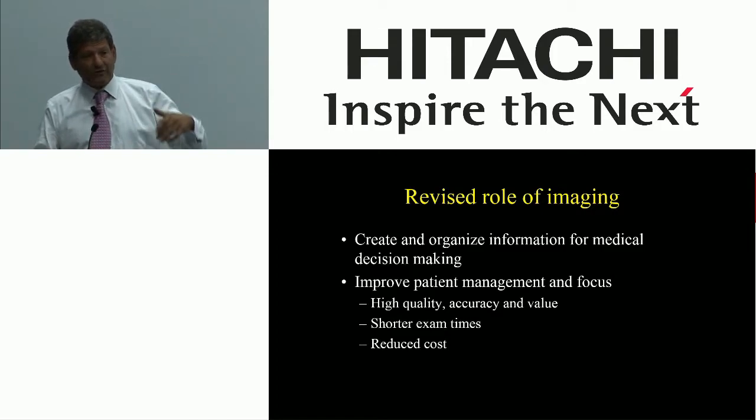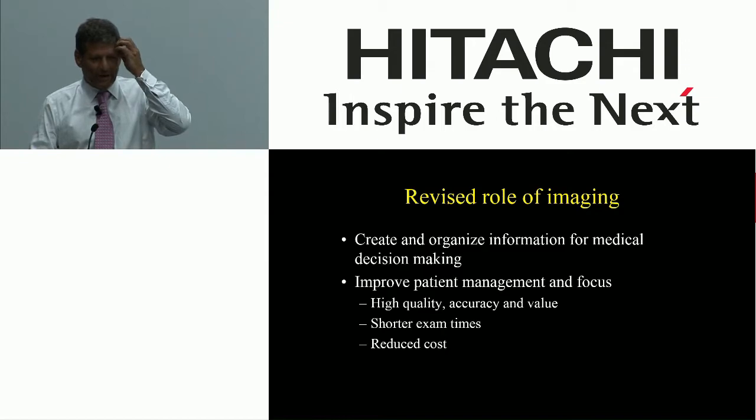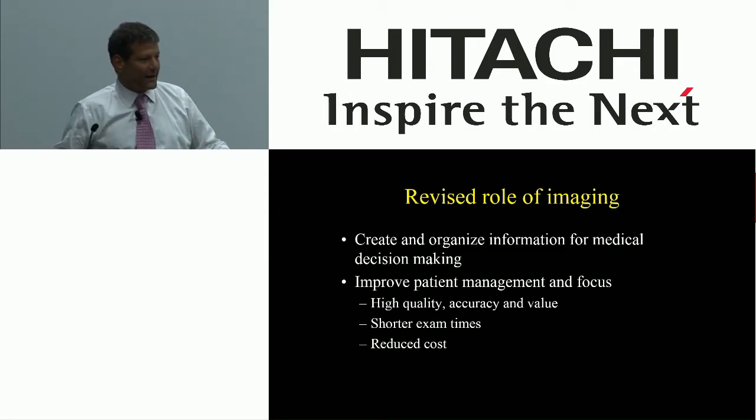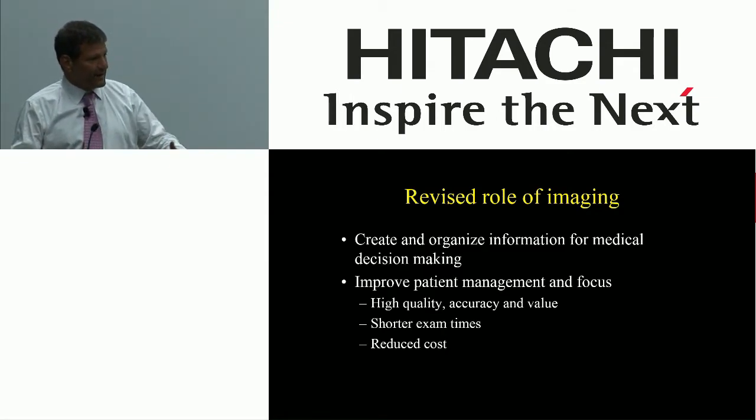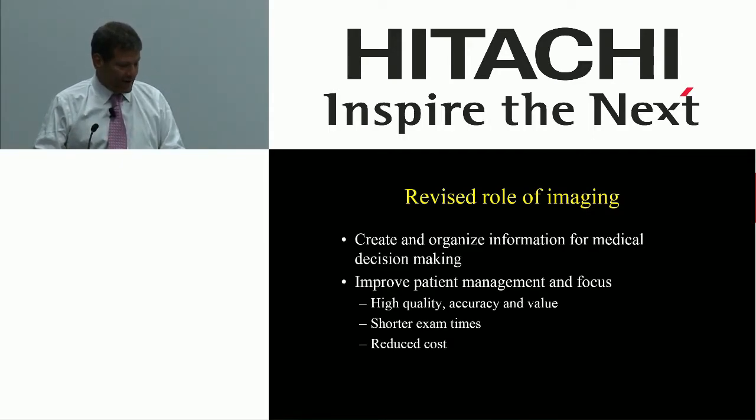And if you heard the contrast talk, you heard how we challenged the value of screening last year. Anybody who was there will now know that the ACR is now following the same guidelines that we began to integrate about 18 months ago, because we didn't see the value in screening before MR contrast agents when we had the right agent in hand.